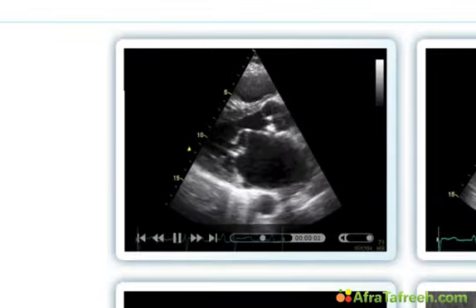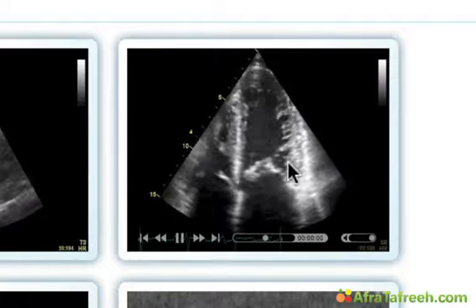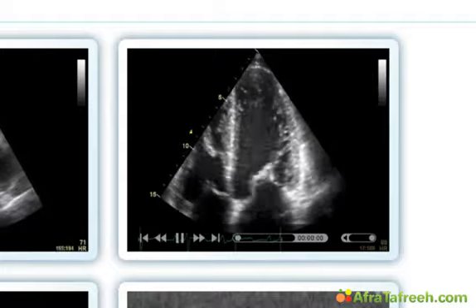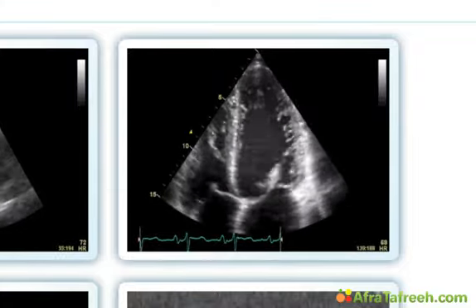Here on the right hand side is a patient who has mitral stenosis, no question, but he also has a reduction in left ventricular function. So this patient probably had a rheumatic involvement of the myocardium.